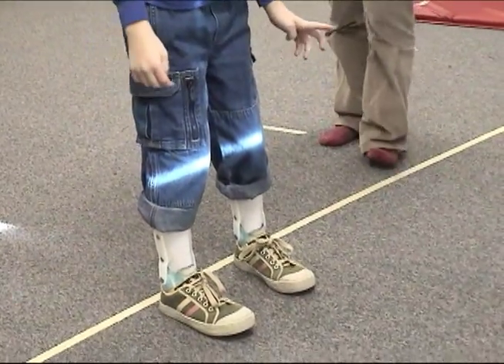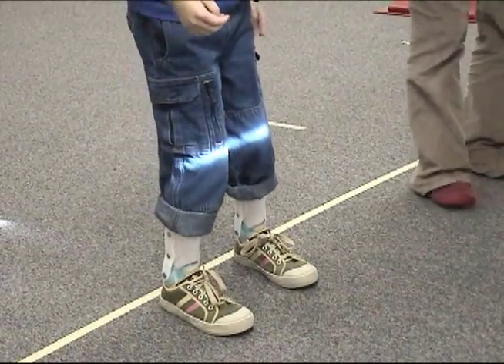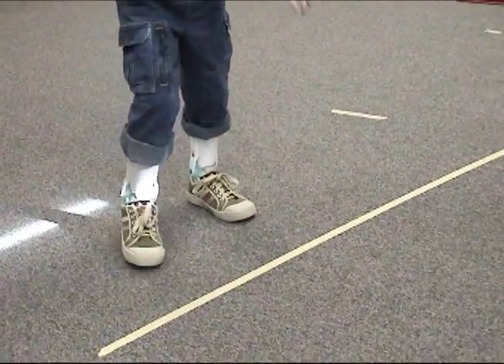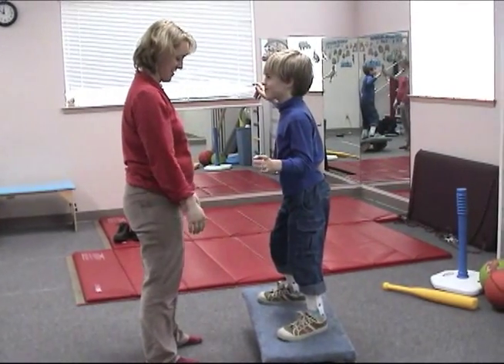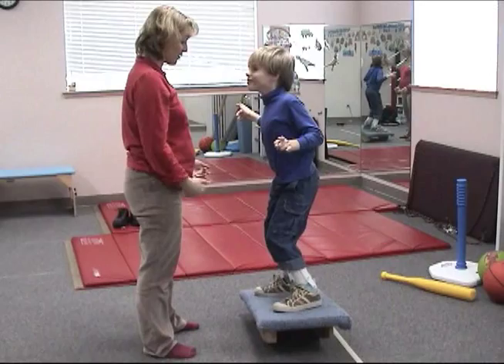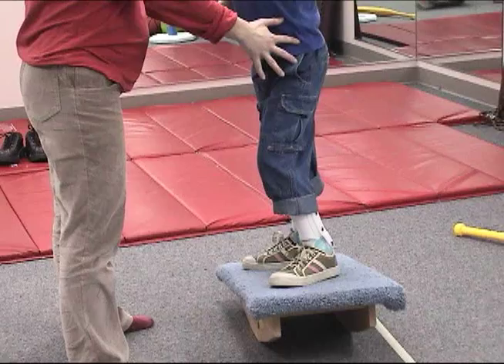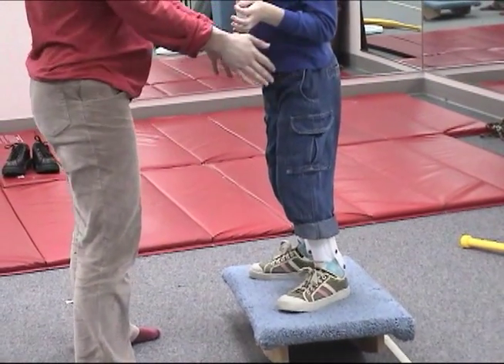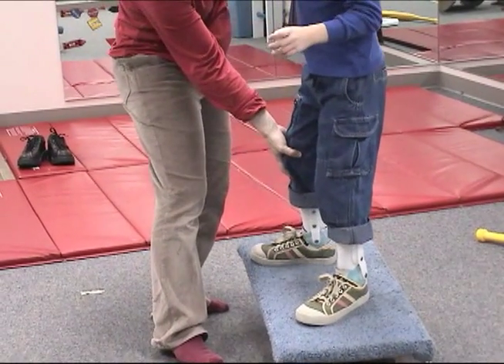It's interesting to note that even though his braces are blocked from a certain range of plantar flexion, he has access to active plantar flexion in the arc of positions that the braces allow. In fact, these number twos require Adam to use active plantar flexion almost constantly when he's weight bearing, whereas his hyperextended position, which he used without braces, allowed him to not use plantar flexion as a primary stability of the knee.